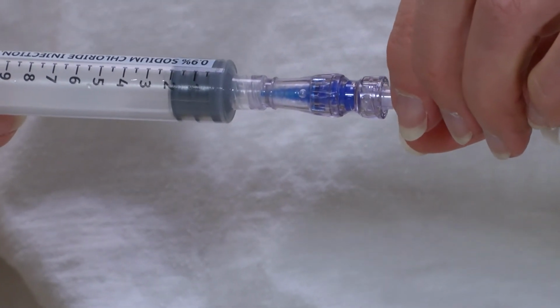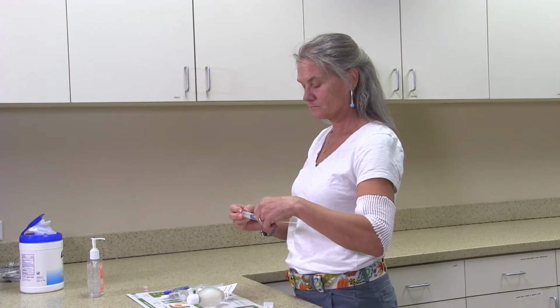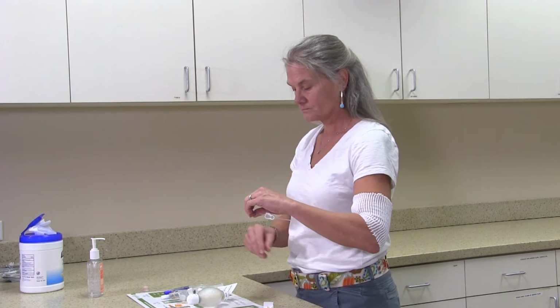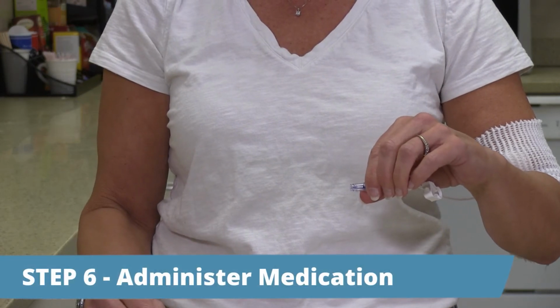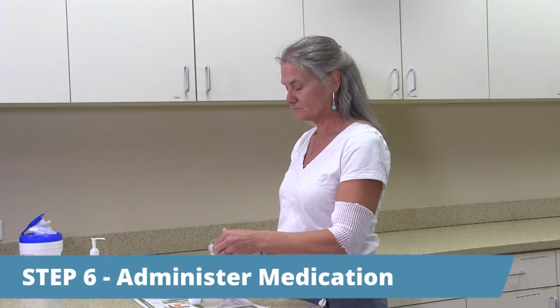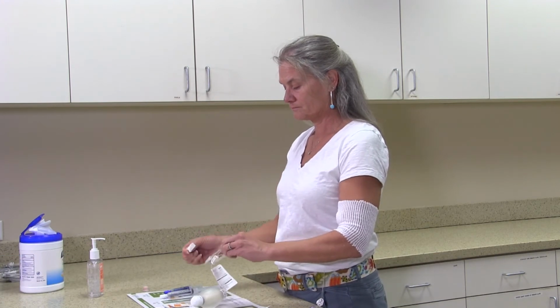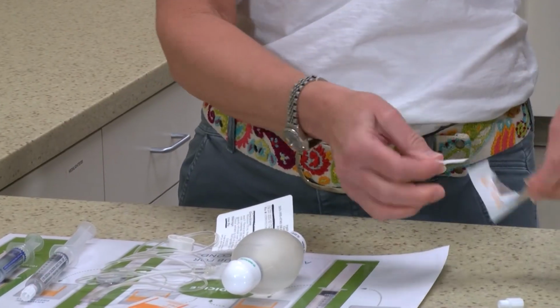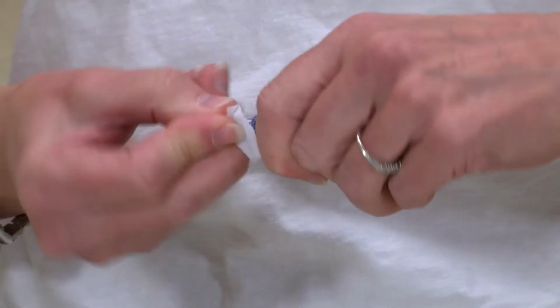After you complete this flush, remove the syringe from the injection cap and throw it away as instructed by your nurse. Step 6, administer medication. You are now ready to administer your medication. Uncurl the tubing of the elastomeric device. Open another antiseptic pad and again, clean the injection cap vigorously for 15 seconds.